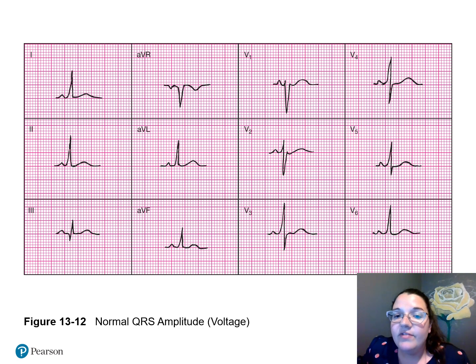We have 5, 10, 11, 12 little boxes here. So it's very close to having excessive tissue. It's dangerous to have that excessive tissue because it takes more current. It takes more amplitude to depolarize that myocardium tissue in your ventricles. Remember, your ventricles have the thickest tissue because they need to pump the blood out to the rest of the body.